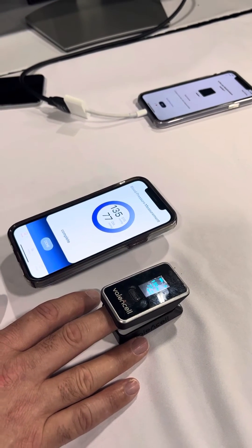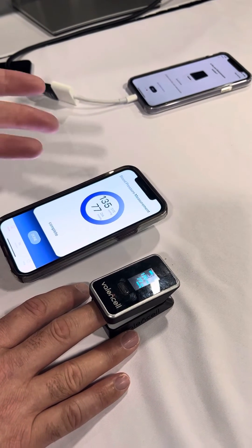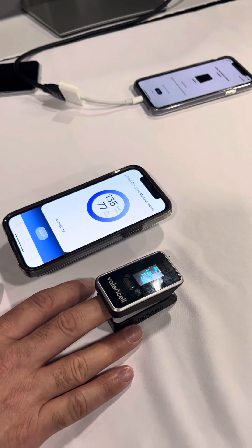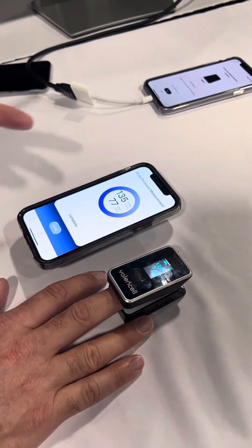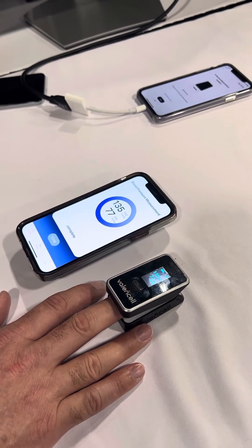Do you get much variation from time to time? So this is my typical CES blood pressure, a little bit elevated — caffeinated, lack of sleep. But traditionally I'm going to be around 129 to 136, 137.